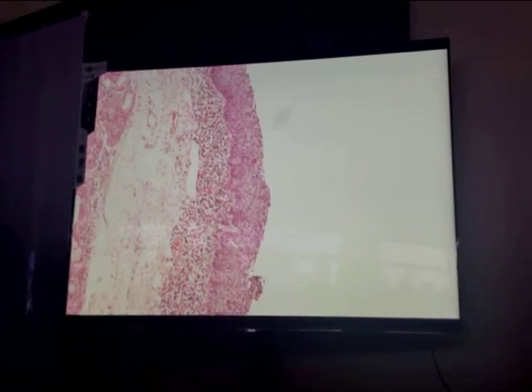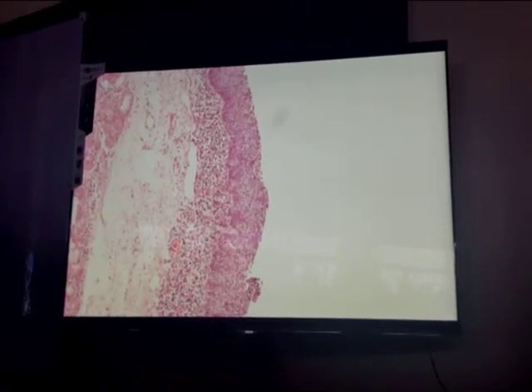Now, the owner of this lung must be a smoker because of chronic injury caused by the chemicals in the smoke. The epithelial tissues of the airway have been transformed via metaplasia into a stratified squamous type of epithelium. That is the most tough type of epithelium present in our body. That is why it is present as the covering of our body. So, mas mayroon siyang resistance against harmful chemicals.